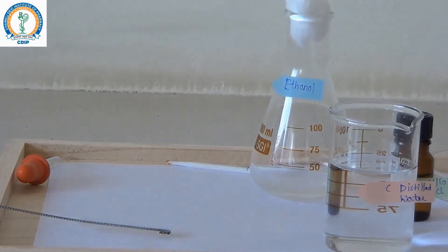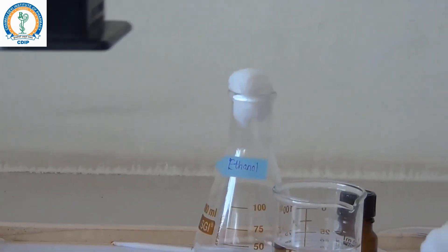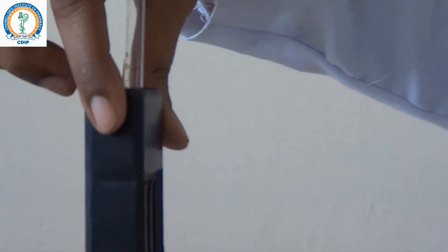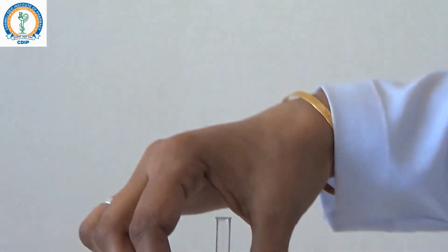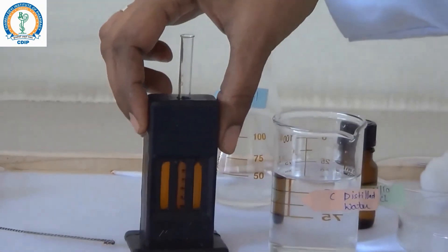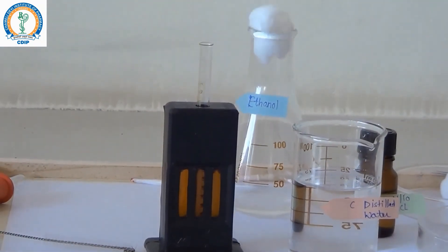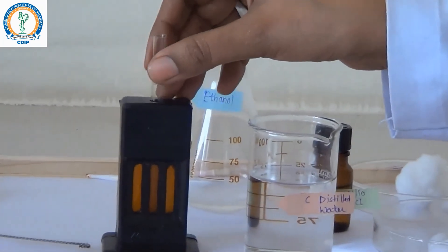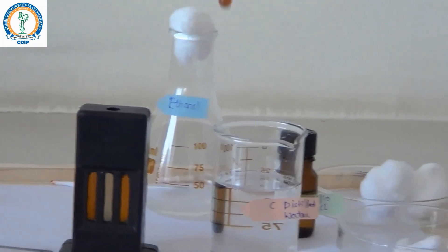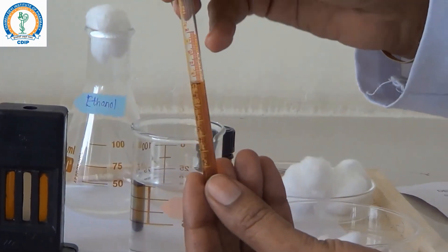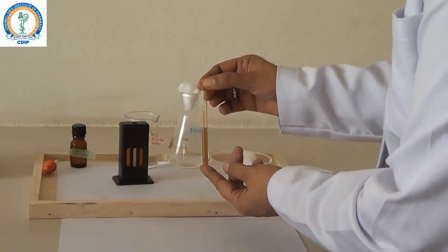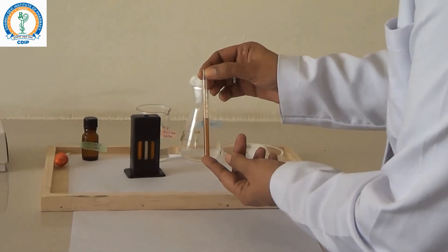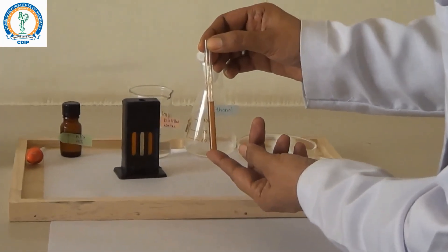Check the color comparison in the light so that it will give you the correct results. Now the tube matches with the comparators. Take out the tube for final reading. Hemoglobin content of the blood is 13 grams percent.